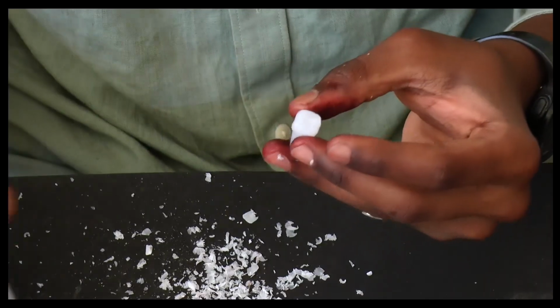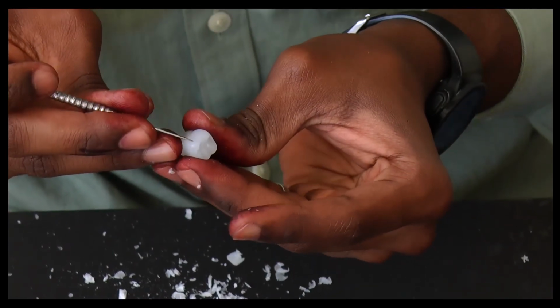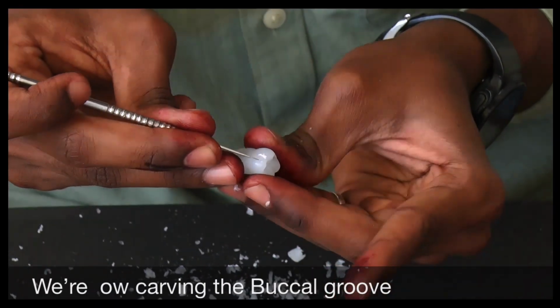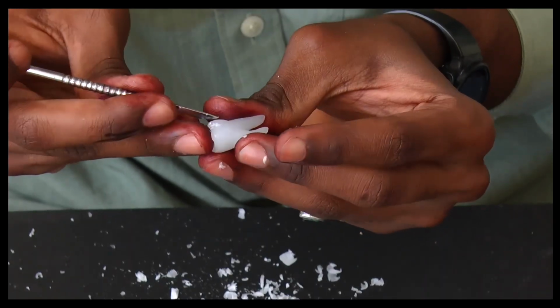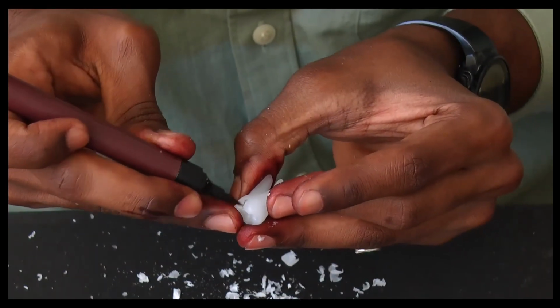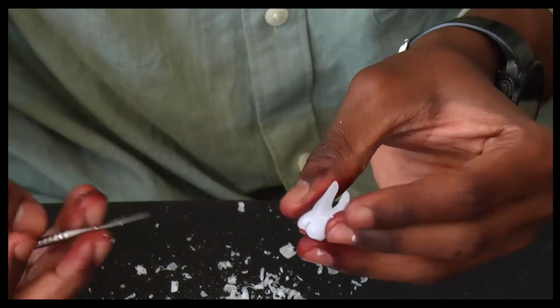Now we have to do something very important, which is drawing a groove on the buccal side. This groove is between the two cusps on the buccal side. This is very crucial. It needs to be a line like this. This line is what I'm referring to.